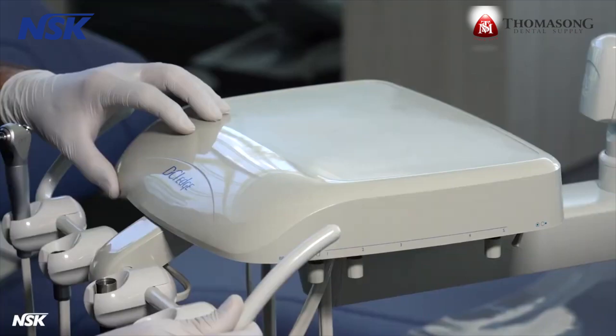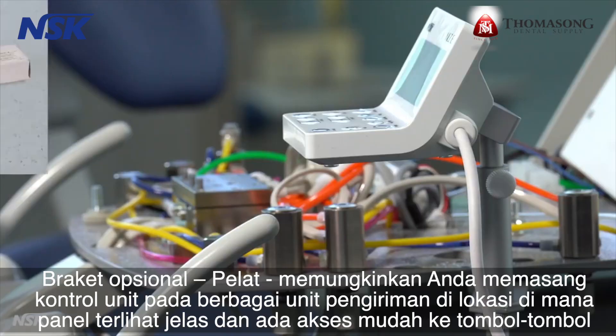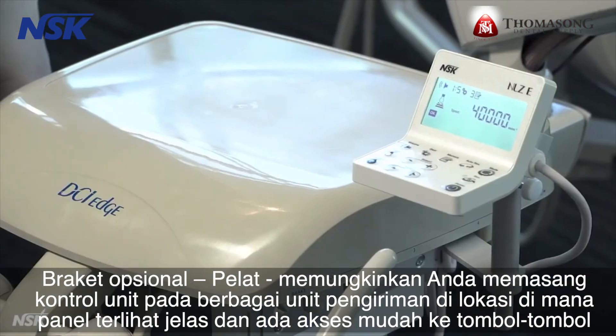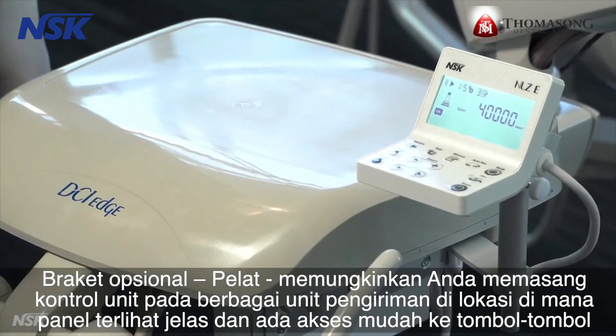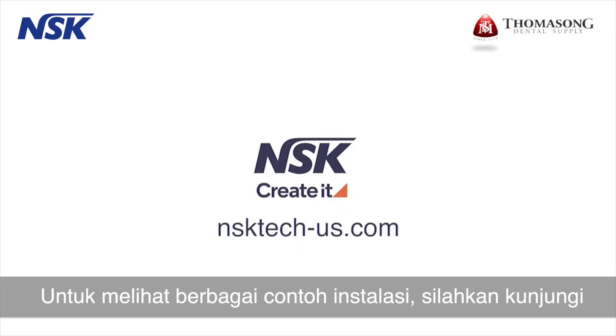The first step is to mount the bracket for the touch panel. Optional brackets — stay and plate — allow you to install the touch panel on a variety of delivery units in a location where the panel is clearly visible and there is easy access to the buttons during procedures. To see a library of different installations, visit nsktech-us.com.